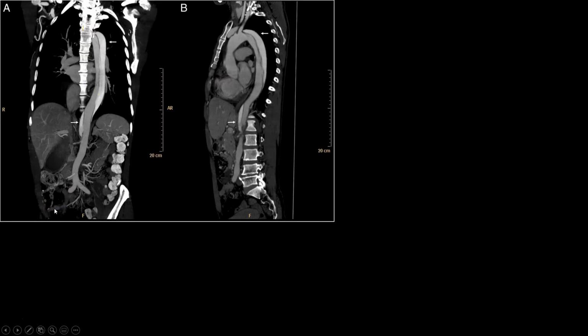The mortality and morbidity of this is high, so catching it early is helpful. So we will talk about how to do it, but I will again stress that this is a specific, not a sensitive test. So normal ultrasound does not by any means rule this out. You need to do more testing if you're at all worried.